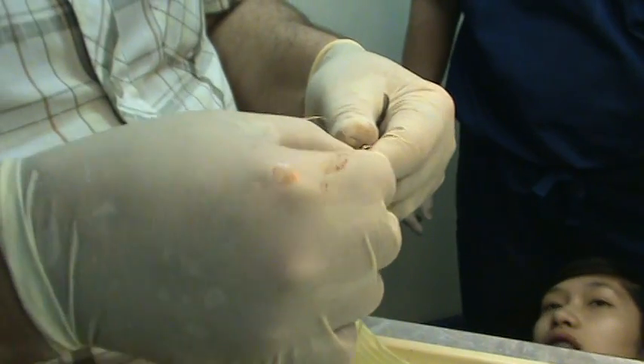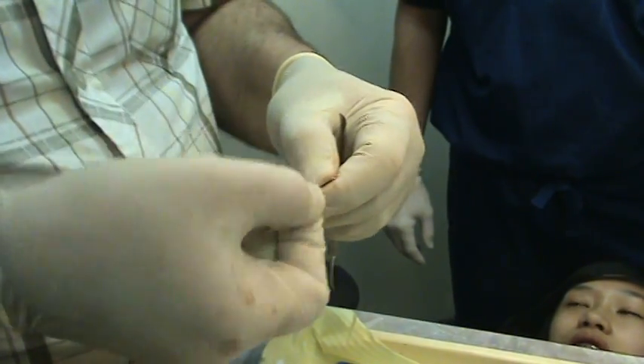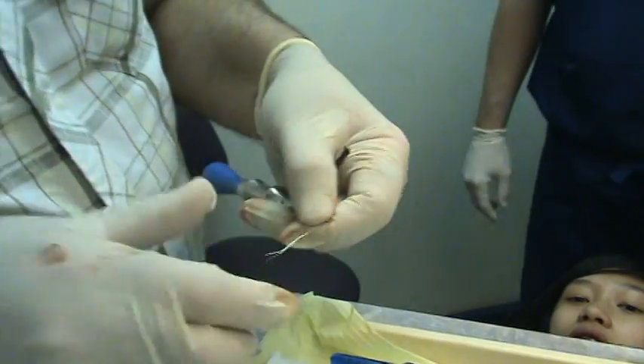Remember, we have screws dropping off all the time? It's not like that — that will stop.